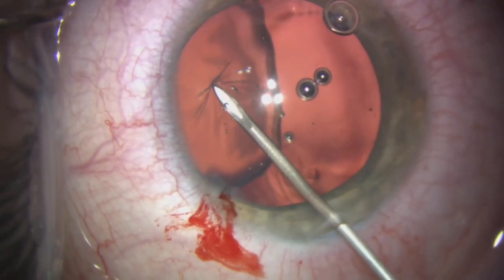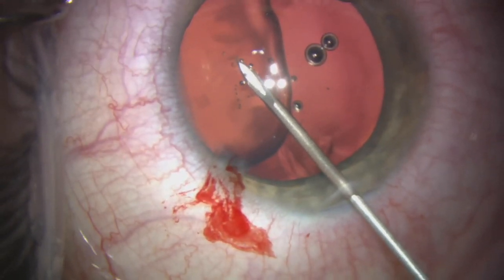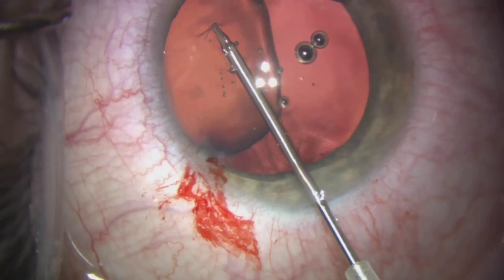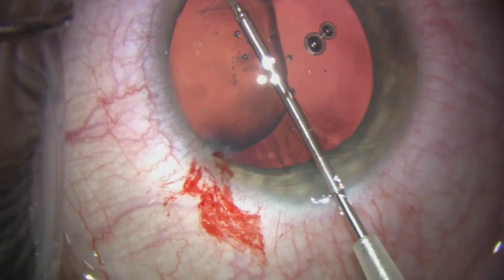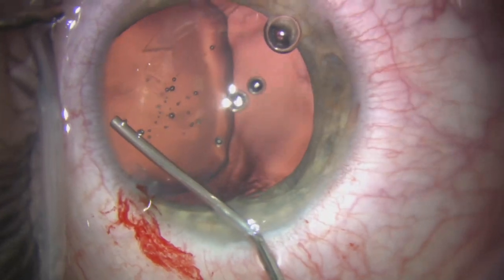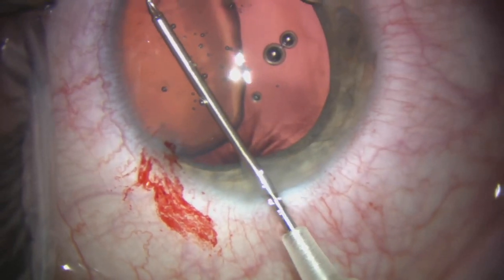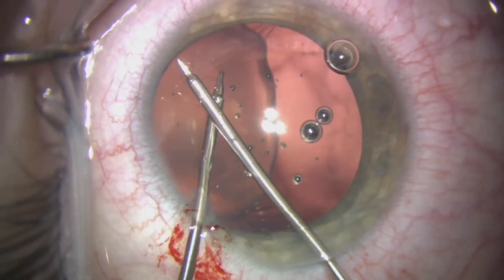Because of the mobility of the lens, we're using a sharp 25-gauge needle to puncture the capsule. The capsulorrhexis is initiated with 25-gauge micro grasping forceps and we really let the capsule tear in whichever direction it wants, then regain control. We're using a little more Helon 5 to gain access to the part of the lens that is less easily visible, so we can complete the rhexis as centrally as possible.